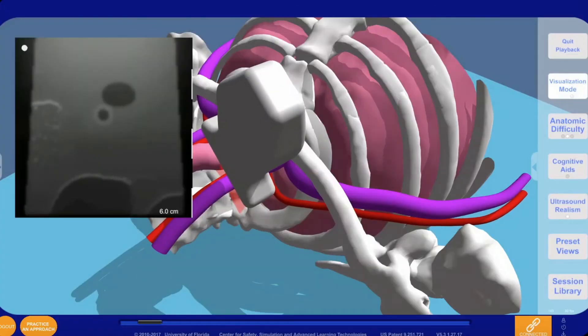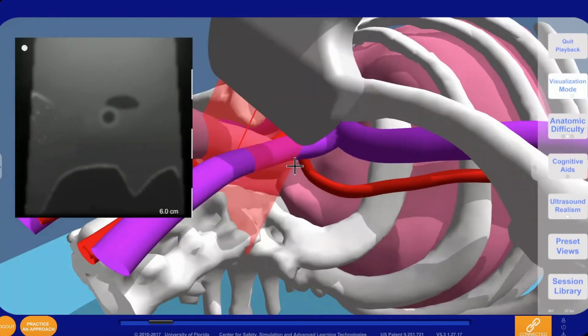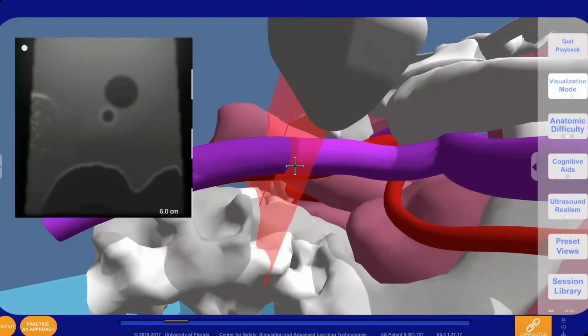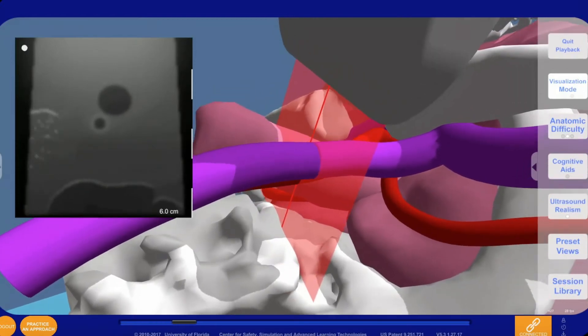Cognitive aids can be used to draw a midline over both the virtual ultrasound image and the insonating plane within the visualization. A sheet of red light depicts the ultrasound insonating plane in the visualization. The ultrasound image can be frozen or flipped for different styles of use.